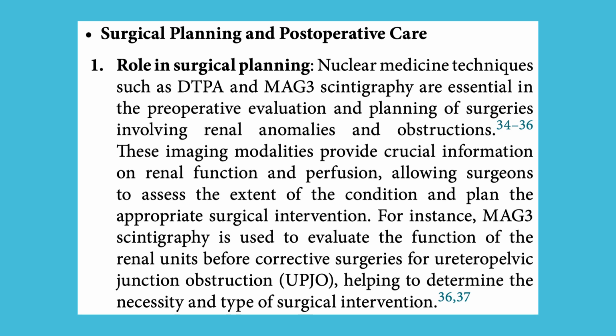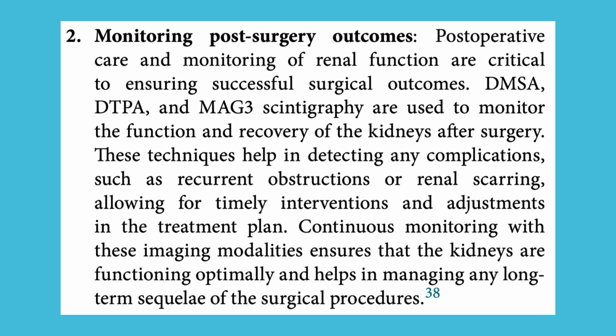For instance, MAG3 scintigraphy is used to evaluate the function of the renal units before corrective surgeries for ureteropelvic junction obstruction, UPJO, helping to determine the necessity and type of surgical intervention. 2. Monitoring post-surgery outcomes. Postoperative care and monitoring of renal function are critical to ensuring successful surgical outcomes.